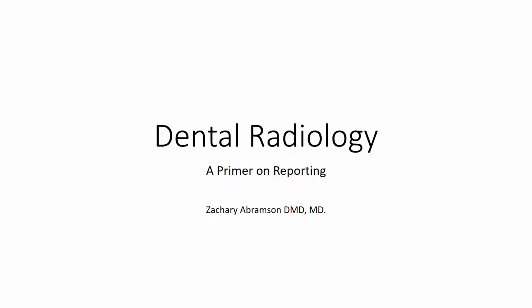So this lecture is entitled Dental Radiology, a Primer on Reporting, and it's meant to serve as a guide for general and neuroradiologists. Much of what is discussed in this lecture does not need to be mentioned in most reports, but in cases where a discussion of dental disease is warranted, I think accuracy and clear language is really important.